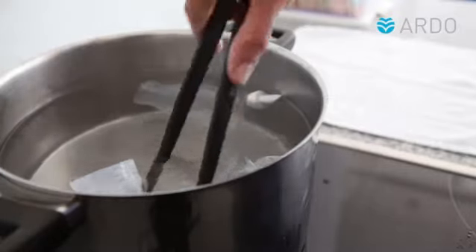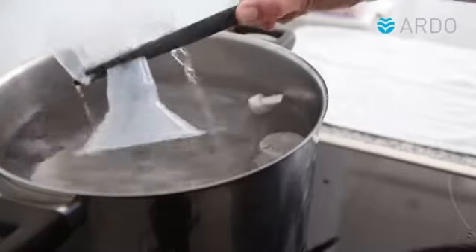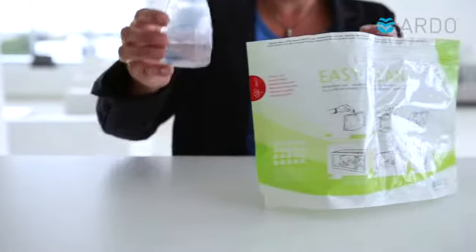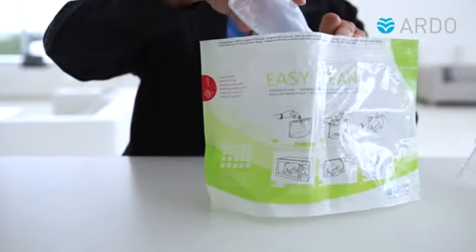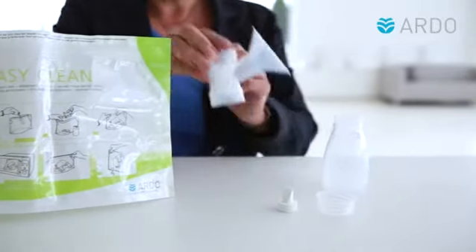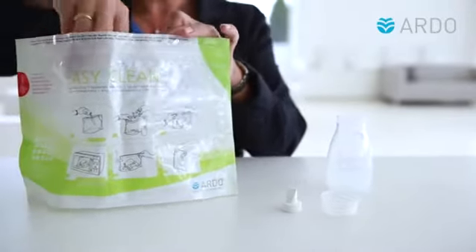We recommend that the washed individual parts be boiled for 10 minutes once a day. The individual parts can also be conveniently steam cleaned in the microwave in the Ardo EasyClean microwave bag. Precise instructions for cleaning can be found on the bag itself.